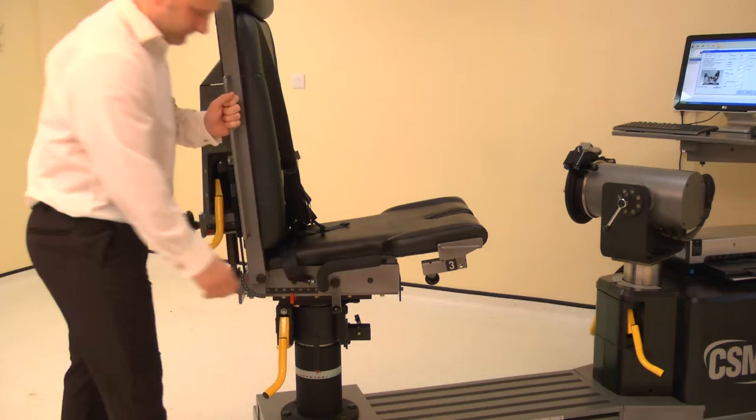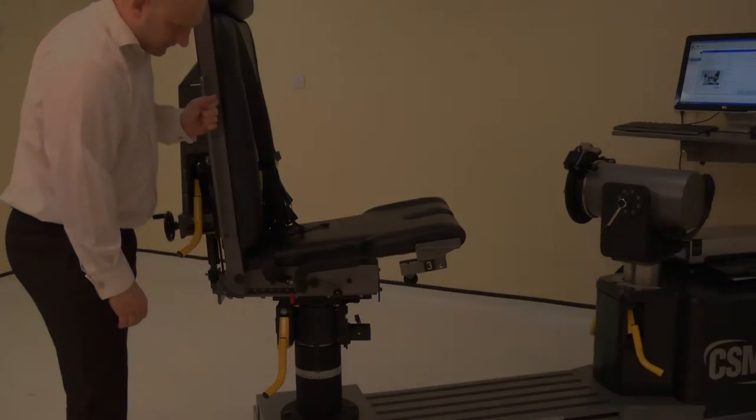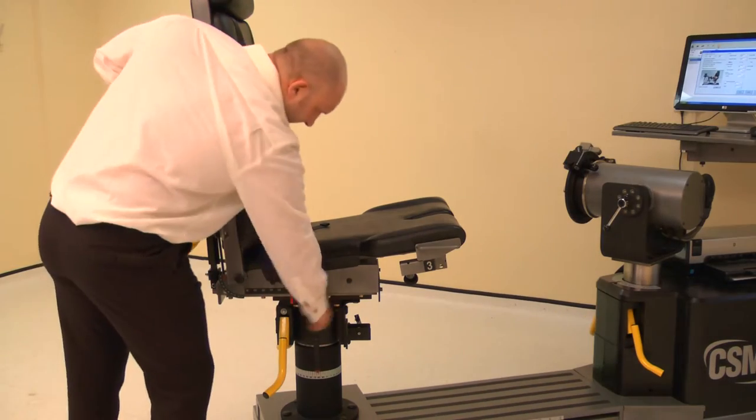The chair fore/aft is altered by raising either locking handle, then slide the chair bottom forwards or backwards. Adjust the chair fore/aft to position 25. Lower the locking handle to secure.